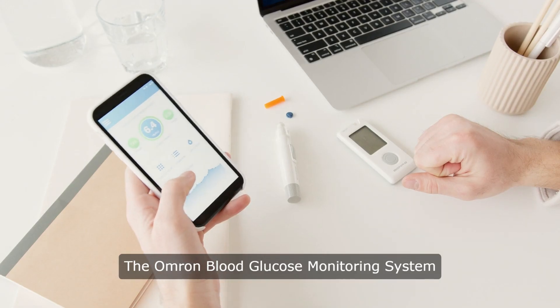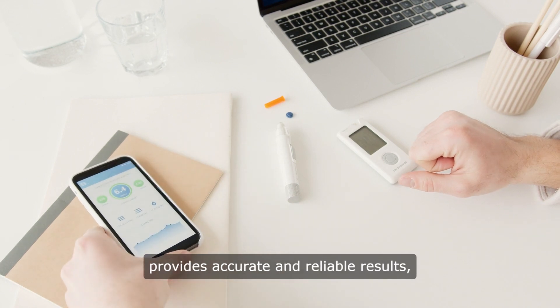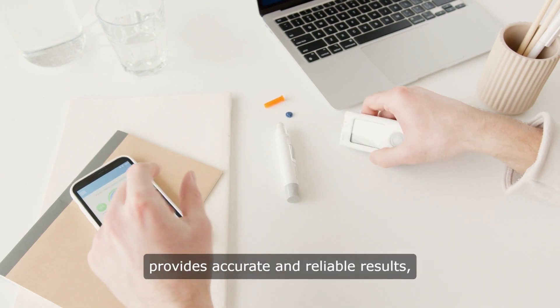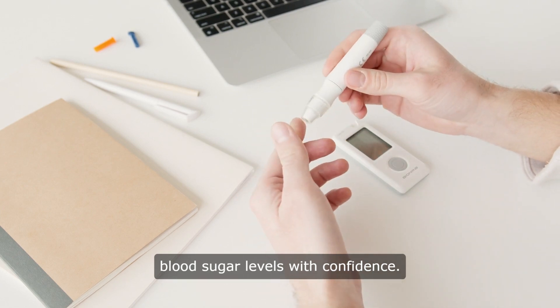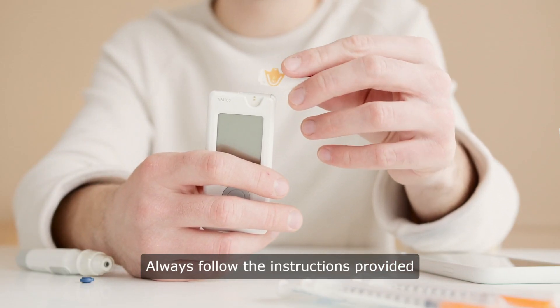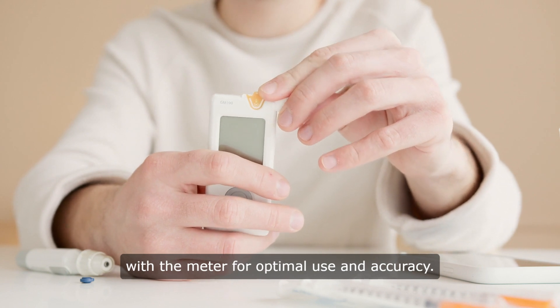The Omron Blood Glucose Monitoring System provides accurate and reliable results, allowing individuals to monitor their blood sugar levels with confidence. Always follow the instructions provided with the meter for optimal use and accuracy.